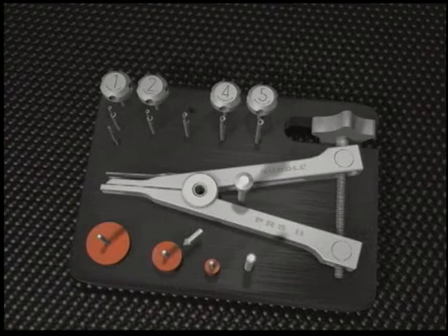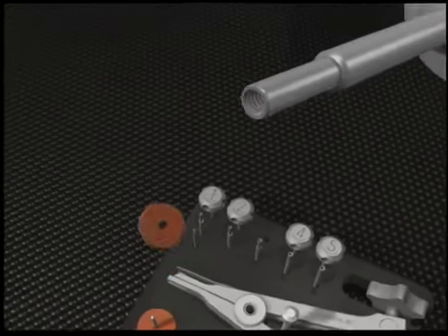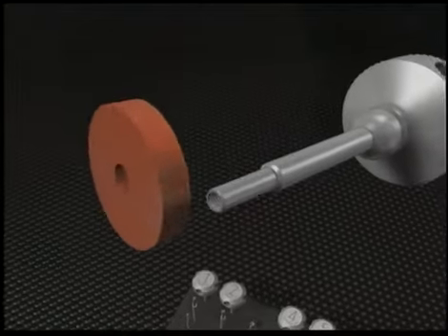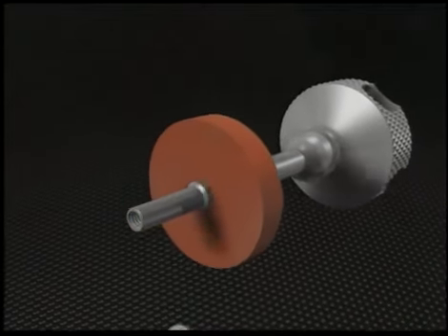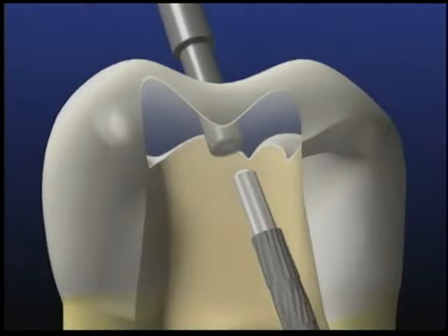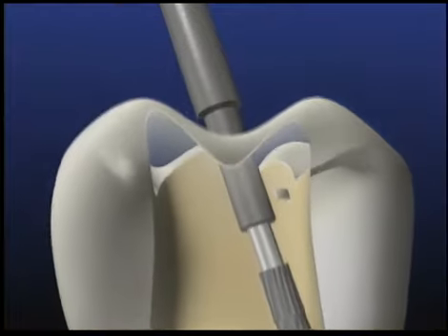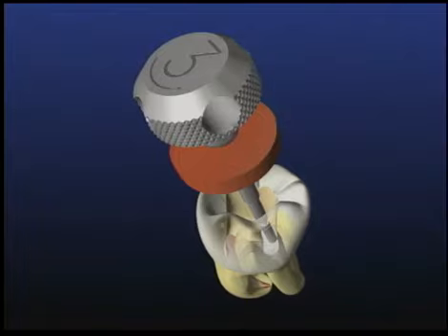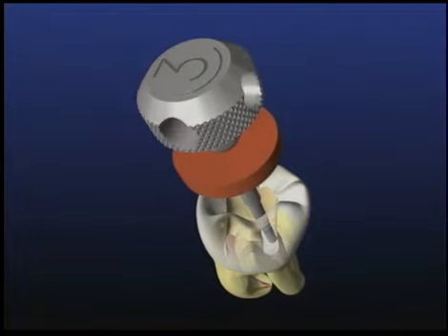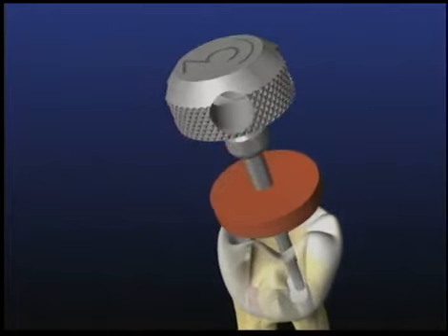A silicone cushion is selected such that it will not be displaced into the access cavity and will distribute the post removal loads evenly over the biting surface of the tooth. This bumper is placed over the working end of the tubular tap. Place the tap over the machined-down post, push it firmly in an apical direction, and screw it on using small quarter-turn counterclockwise rotations. The tap forms threads on the post and is drawn down until snug. Slide the cushion down so it contacts and protects the tooth.